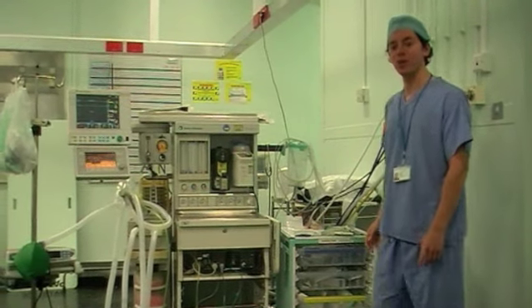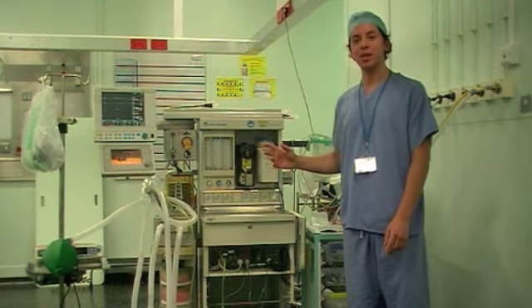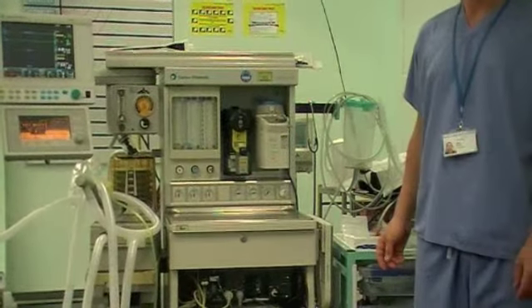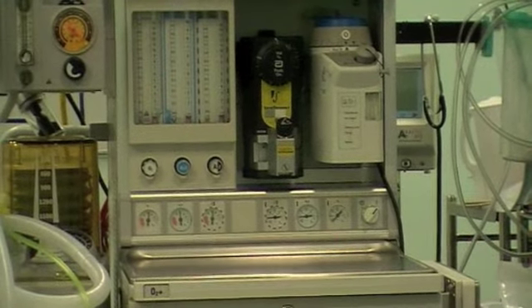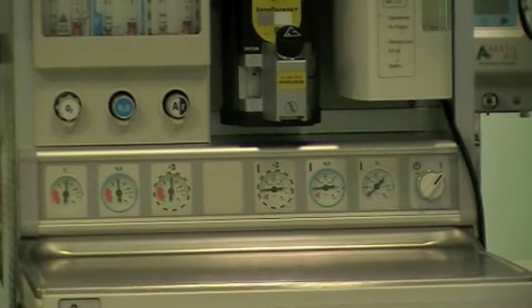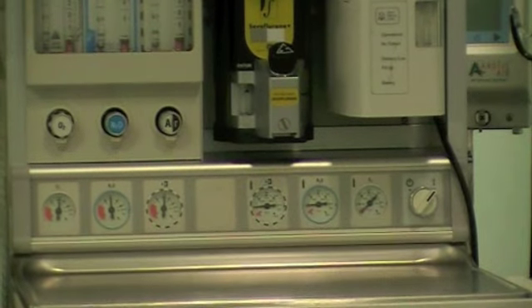Now you want to make sure that there are cylinders on the back of the machine and they are all full. Go round the back of the machine, turn the cylinders on, and you will see on the cylinder pressure gauges they should all be full — 44 bar for the nitrous oxide and 137 bar for the oxygen. Once you are happy that you have full cylinders, ensure that they are turned off and will be available to use in an emergency if your main pipeline supply runs out.